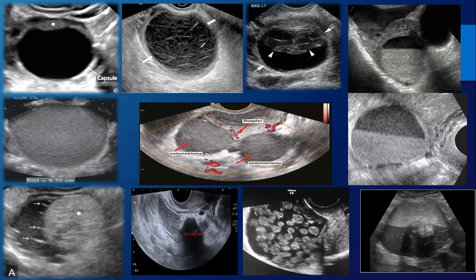Then in the second part we discussed more complicated things — the hemorrhagic cyst. It has three appearances. It can be lacy, where the lines are connected to each other and reach the wall. It can also show clot retraction, and importantly there is no vascularity. Or it can be a fluid level, where the dense sediment is in the lower part and the upper part is completely anechoic or black. In contrast, the endometrioma is gray.